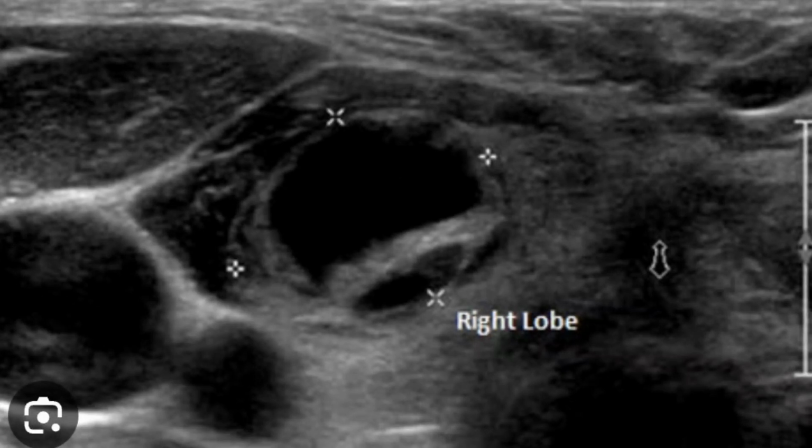This is another example to clarify this phenomenon: whenever there is a nodule, there may be associated lymphadenopathy. Also pay attention to the lymph node characteristics, because sometimes this malignant nodule may be associated with lymphadenopathy and might have metastasized to the associated lymph nodes, which will further give rise to particular features like necrotic changes within the node.